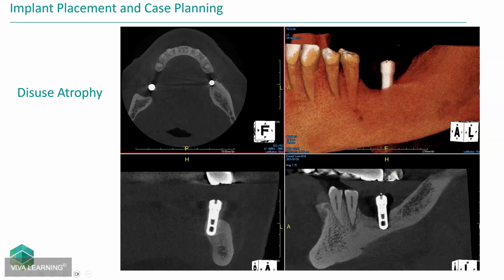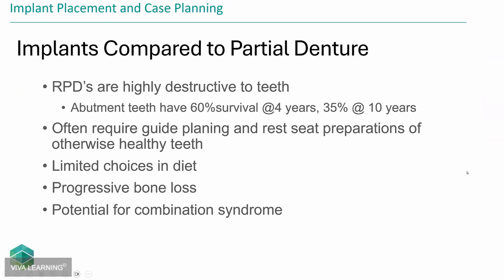non-restorable. You can say what you want about the placement. I have questions about that as well, but the non-loading of them meant that we had to pull all these implants out, and we had to develop the site and go back in and do new implants. And you can see that saddling that has occurred because of that bone loss.